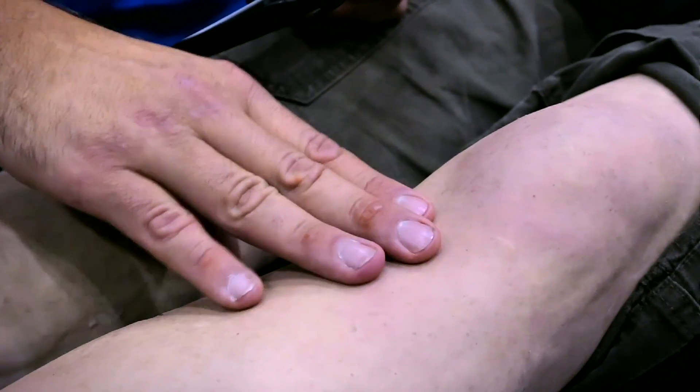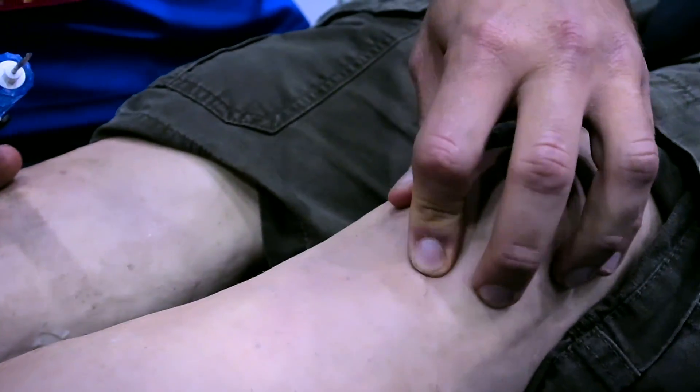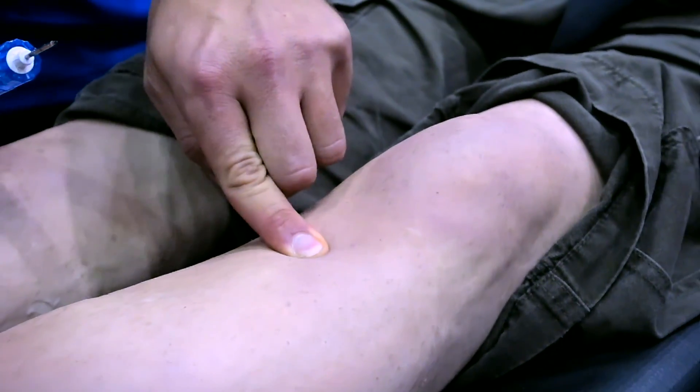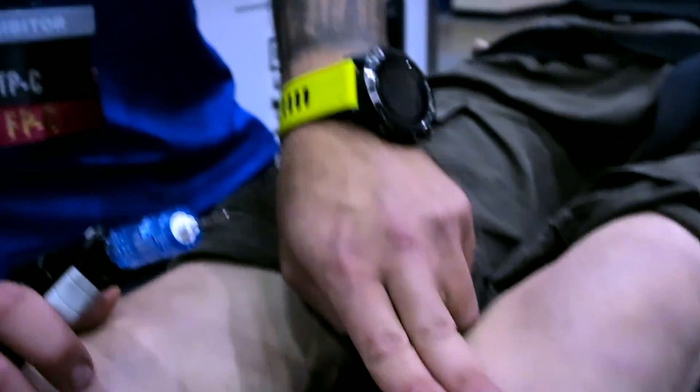In order to landmark for intraosseous access on the proximal tibia, find the knee, find the patella, and then move yourself a couple of inches below and a couple of inches medial and you will be right on the flat side face of the bone where you want your needle to go.